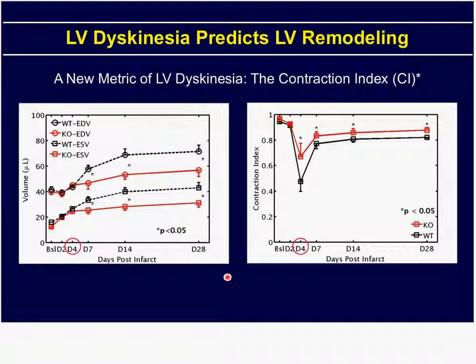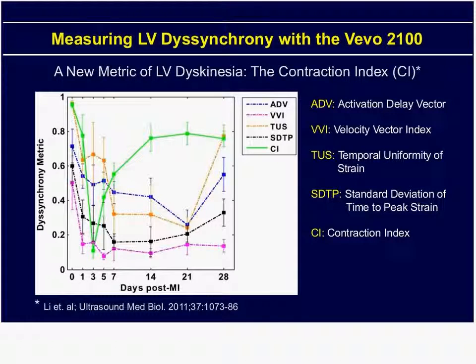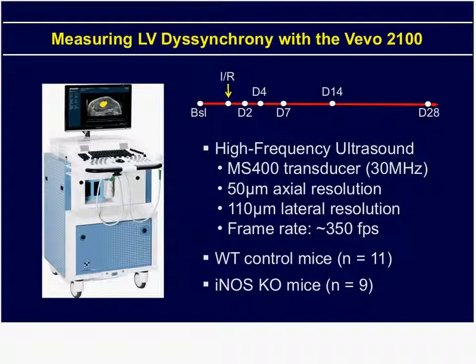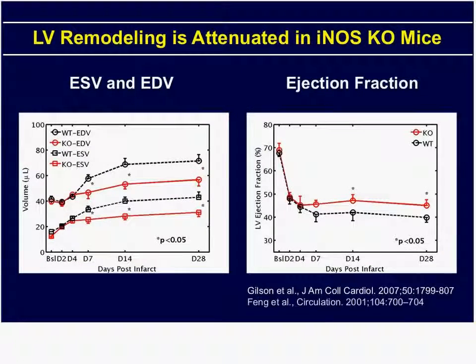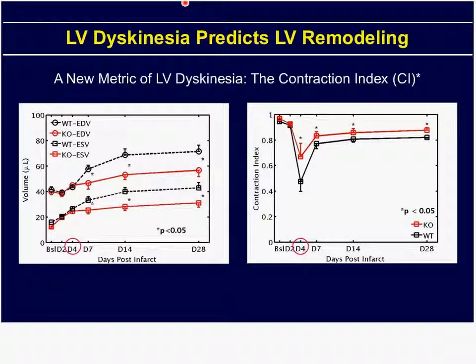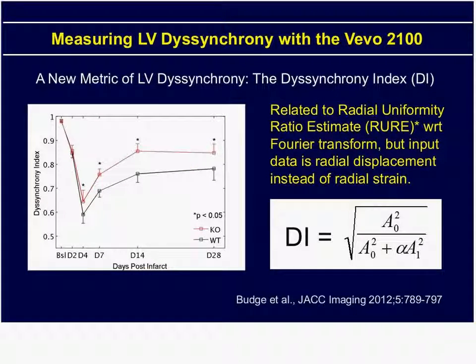Just to make that clarification, for the two-dimensional images you see, that is done with the Vivo strain software. However, the reconstruction of those 3D sets was done with the group at UVA by taking those values and then using an in-house program to show that.